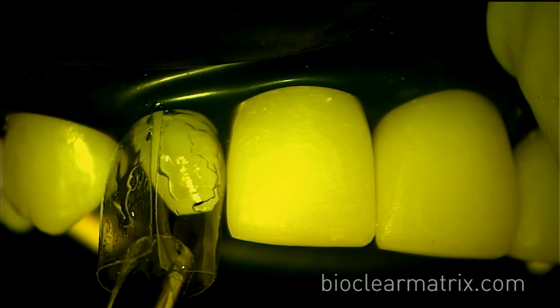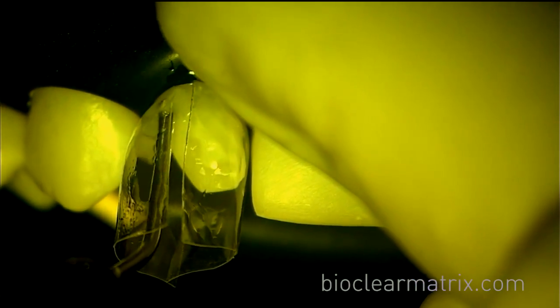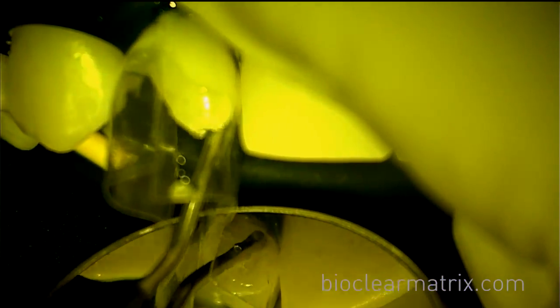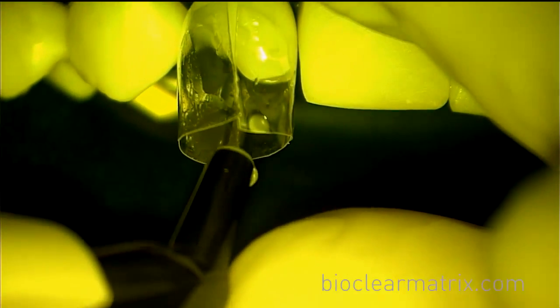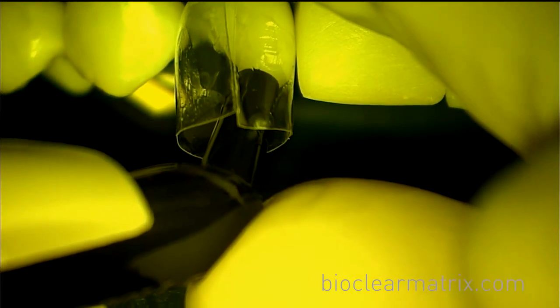Air thin, then inject heated flowable apically into all interproximal spaces. Inject flowable from facial and lingual. Inject the heated composite into the pool of uncured flowable.